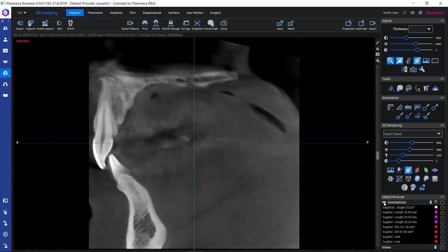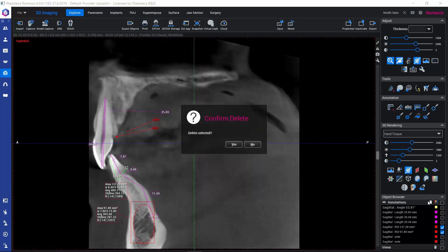We can make them visible again by clicking the eye icon again. If we would like to get rid of some annotations, we can select those we want to remove and then use the trash can icon next to the annotation group.